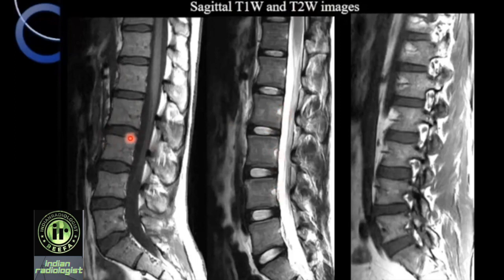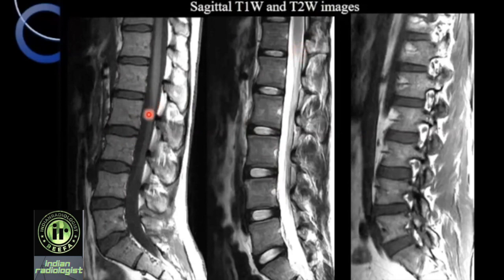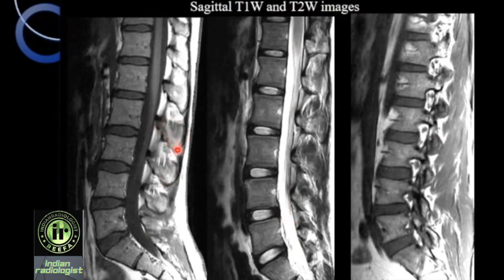Again, this is the vertebral body, the cortex of the endplate, nucleus pulposus, annulus fibrosus. This is the conus medullaris, seen here again on T2 also. This is the CSF in the thecal sac, which is dark on T1 and bright on T2. This is the spinous process, the anterior cortex of the spinous process, and the posterior cortex of the spinous process.